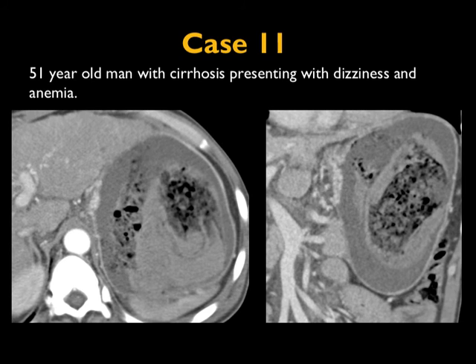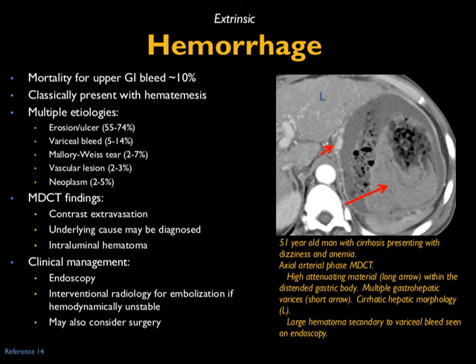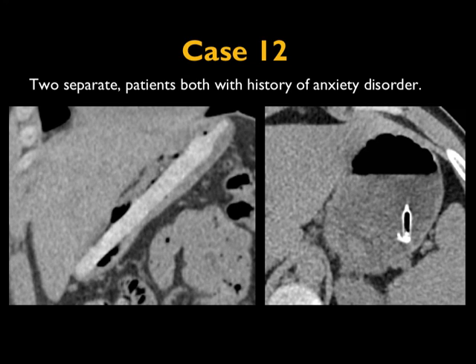Another case: patient with cirrhosis presenting with dizziness and anemia. The stomach is well distended but there's high-density material in the stomach consistent with a bleed. Mortality for upper GI bleed is under 10%. Causes include ulcer, variceal bleeding, Mallory-Weiss tears, vascular lesions, and neoplasms. With active GI bleeding you may see contrast extravasation or, as in this case, an intramural hematoma. Clinical diagnosis is usually made via endoscopy, though it can be difficult when there's food in the stomach. Endoscopy can also be used to stop the bleeding, as can surgery, making patient management very critical.